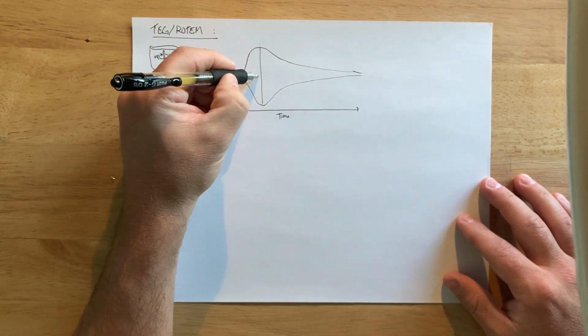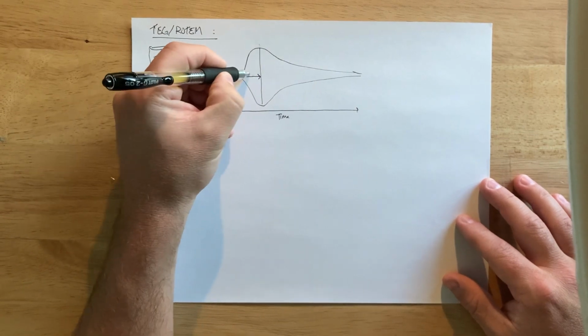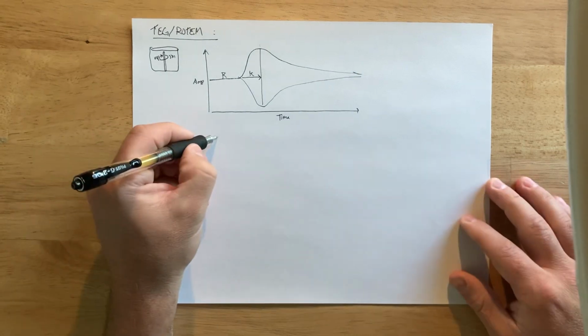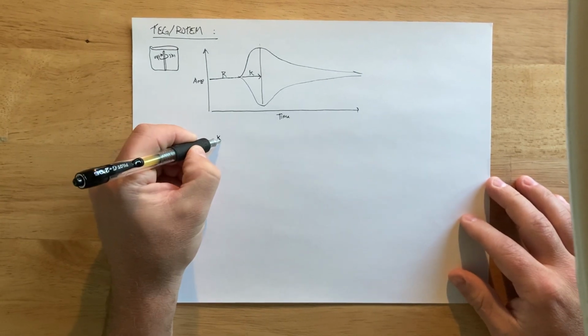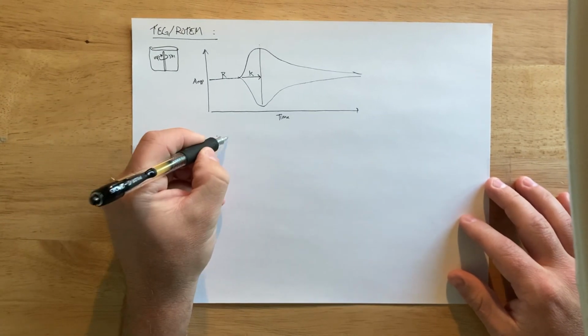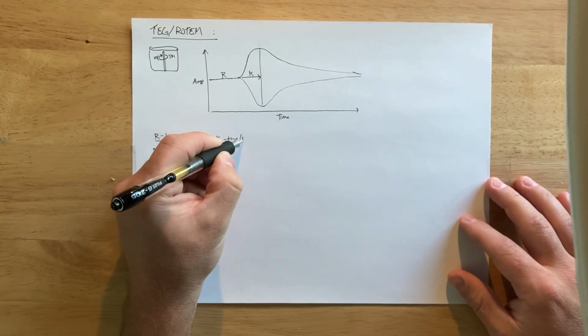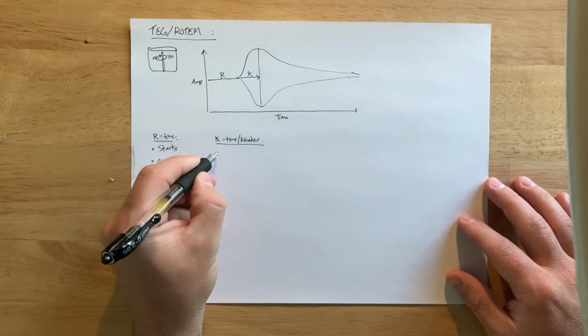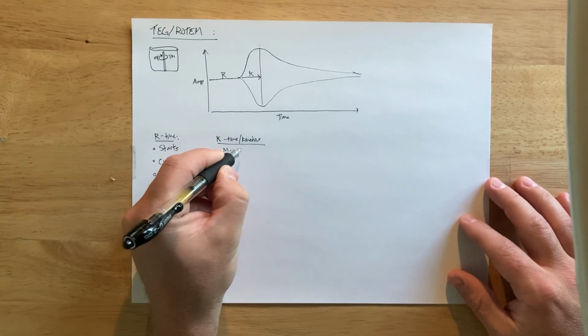Okay. So once this starts, then you have a point where this clot is at its max, or max strength. And this is called your K, or your kinetics. So K is the time, or kinetics, to max clot strength.